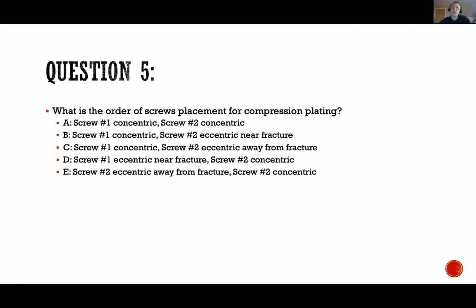And the centricity, Jeremy, that you're talking about there, you're referring to the centricity within the hole of the plate, right? Correct. And then it's the same question for screw number 2. So when you're doing this, remember the first screw is anchoring it, and then the second screw is doing the work of the compression.